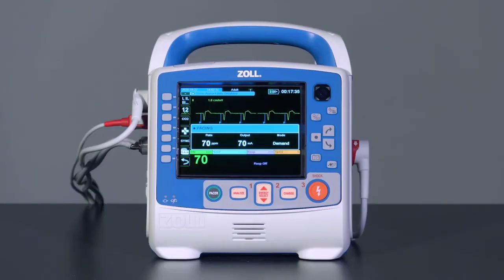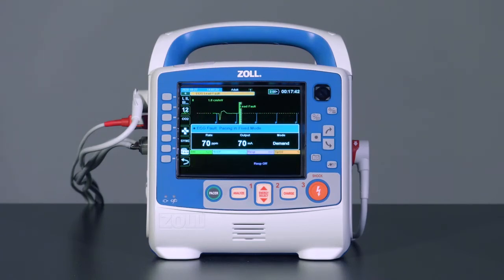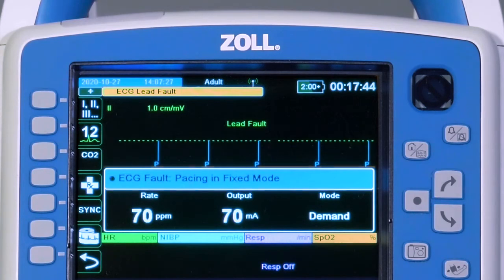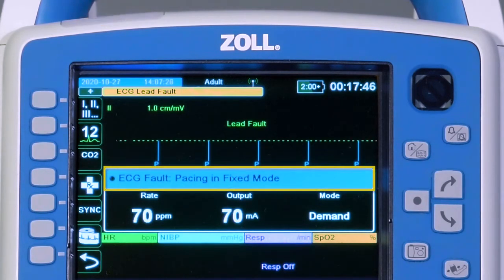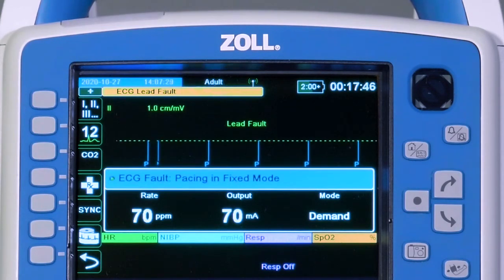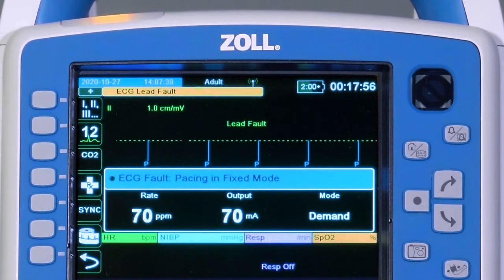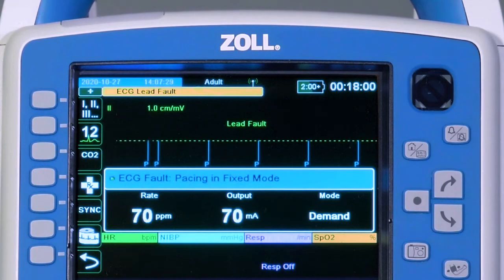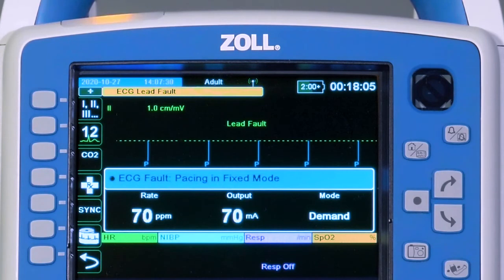If a limb lead is removed during demand pacing, a device alarm will sound and the yellow LED will illuminate. In the pacing dashboard, the message ECG Fault, Pacing in Fixed Mode will be displayed. The alarm can be paused for 15 seconds by selecting Alarm Pause. The X-series Advanced switches from demand to fixed pacing so that capture is not lost, and continues to pace at the same settings that were being used prior to loss of the limb lead view.